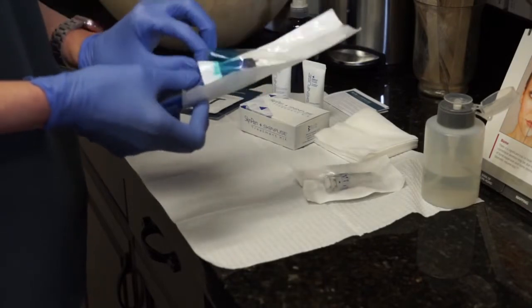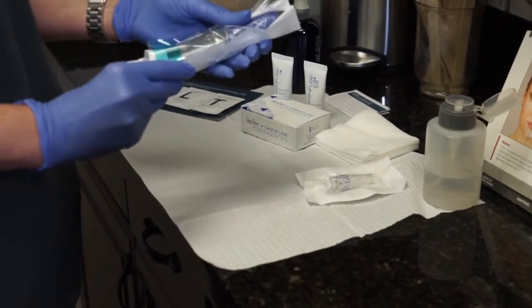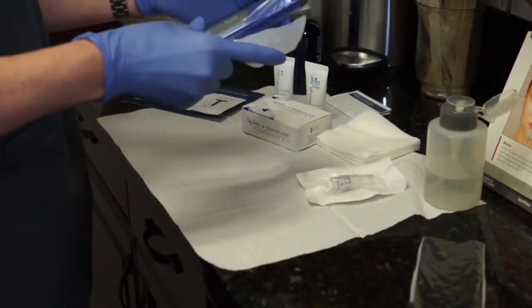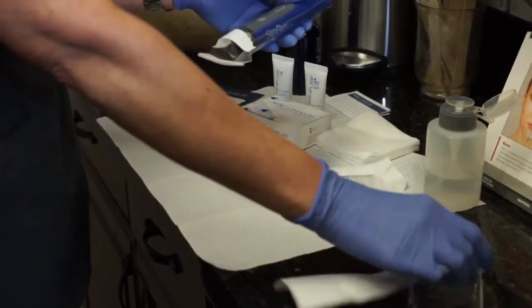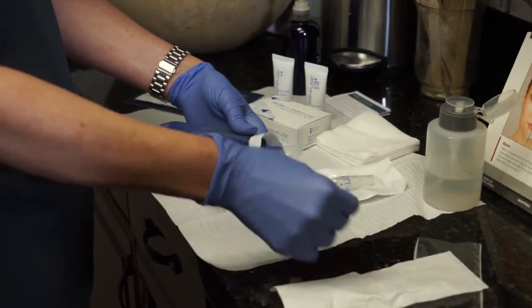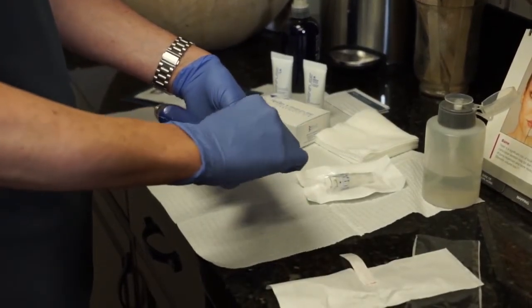With gloved hands, hold a clean SkinPen in one hand and a new BioSheath in the other. Lift the white tab and slide the device between the plastic and paper backing until snug. Peel off the cover by pulling the blue tab upward and the paper backing off. Then, remove the white tab to seal the device.